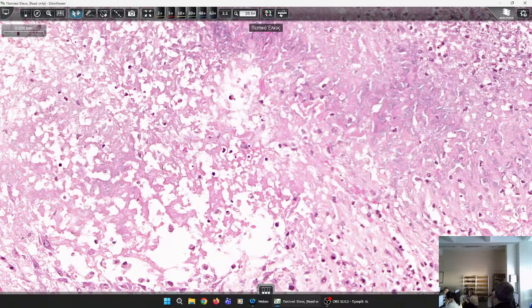And if you perform a biopsy in the kidney, you see that apart from the thickening of the arteries in the renal parenchyma, in addition to the thickening due to hyaline deposition, you also see fibrinoid necrosis. It's correct. This is another lesion where you can see this type of necrosis. The wall of the vessels in vasculitides, the ulcer bed quite superficially, and the malignant hypertension lesion of the renal parenchyma. Excellent.